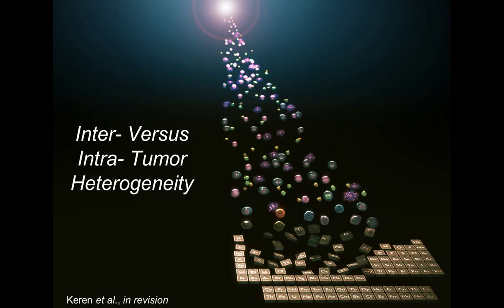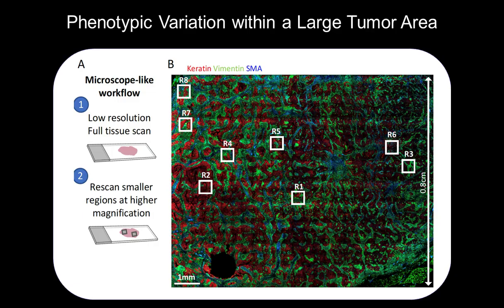So what I wanted to give you guys a little bit of an update on is where we've gone from there, because it leads into having to scan larger areas and do larger scale comparisons, which again I think are really important for neuropathology. So with this particular study, like I said, we sampled only single fields of view across a large number of patients. And one of the questions we always got was, well, what about intratumoral heterogeneity? How does it vary across a tumor between tumor sites?